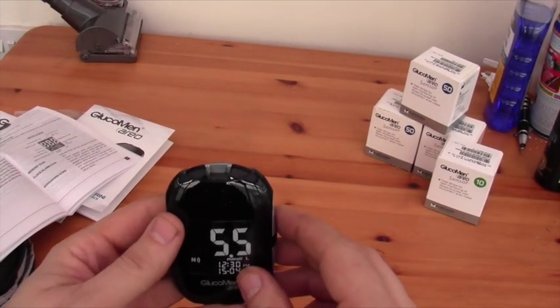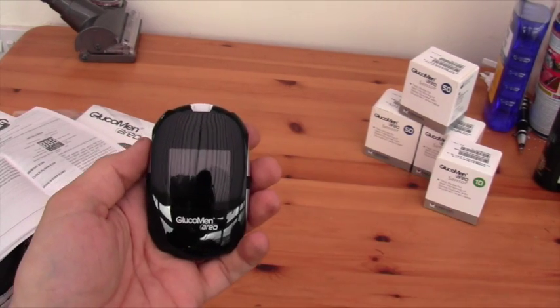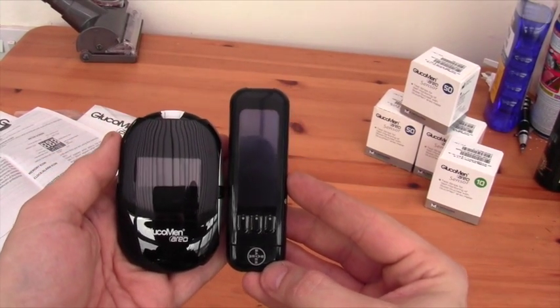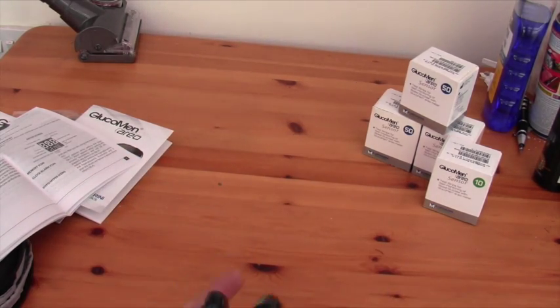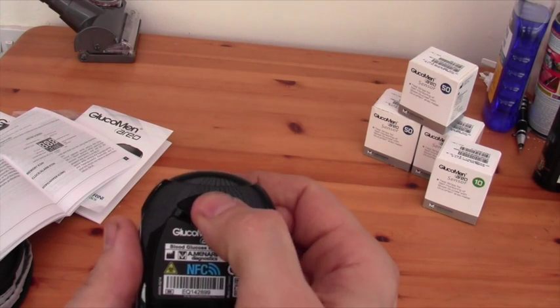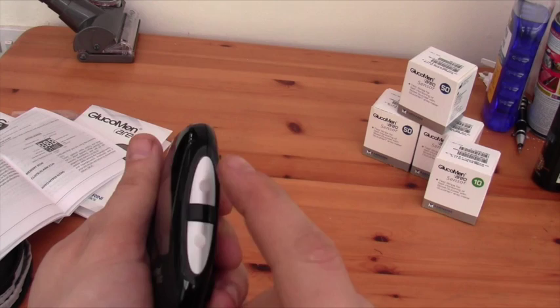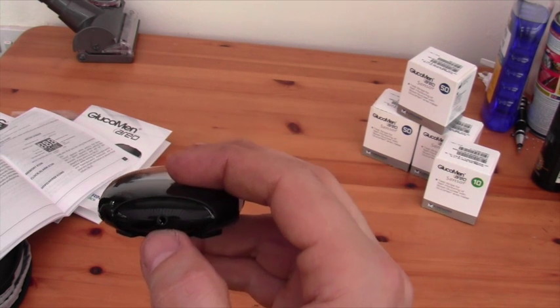Let's take a look around the meter. Just for comparison purposes, I'll hold it next to my Bayer Contour Next. It's slightly shorter but obviously slightly fatter. Thickness and weight are about the same. Test strip port is on the top. On the back is a push button to eject the test strips. There's an on and memory button on the side, and then up and down buttons. On the base is just a port that you can connect to the computer with.